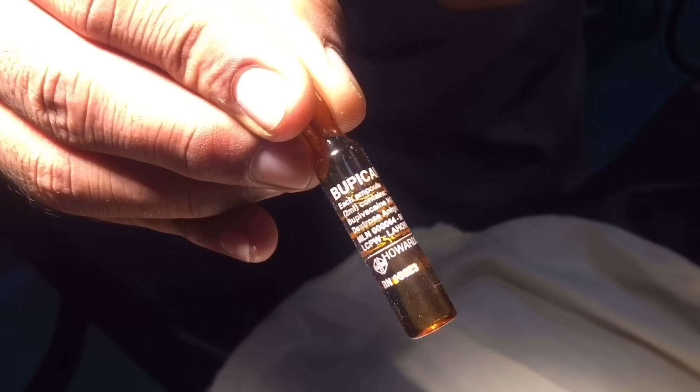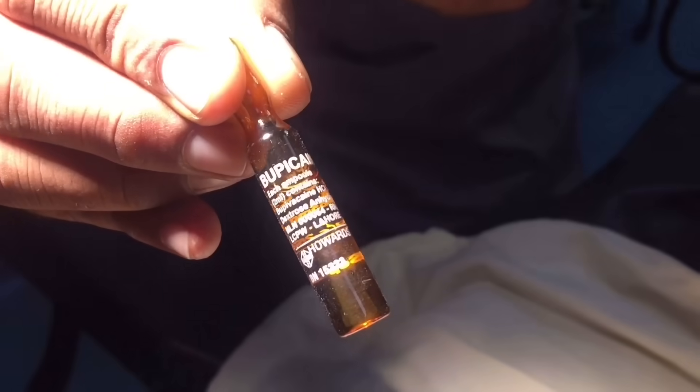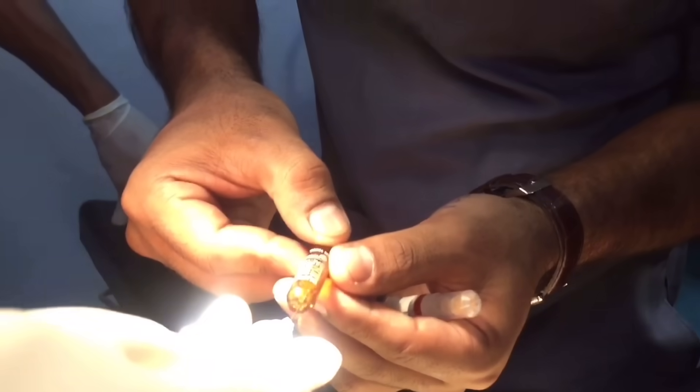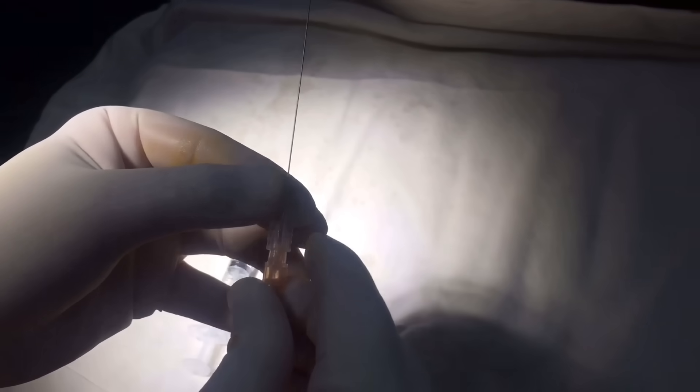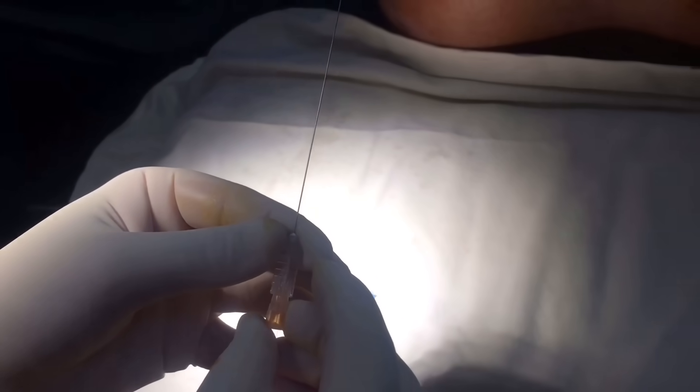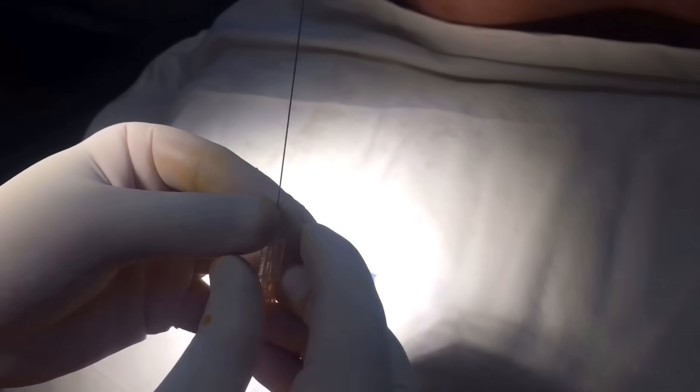Through the midline approach, we access the subarachnoid space between the spinous processes. 0.5% bupivacaine is used as local anesthetic. The 25 gauge spinal needle is used.